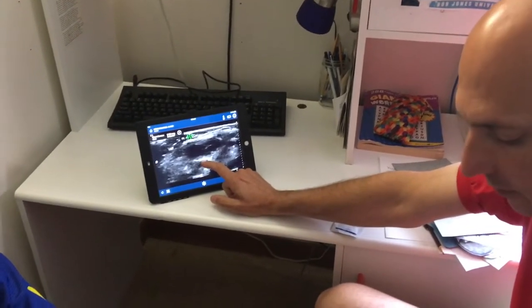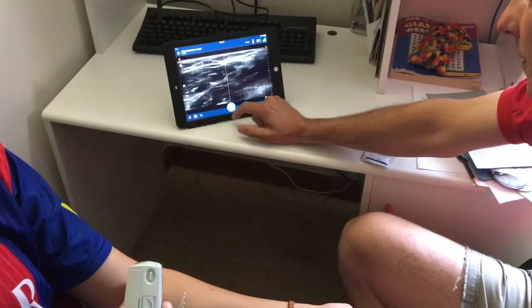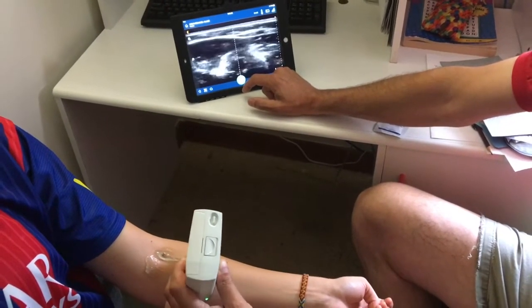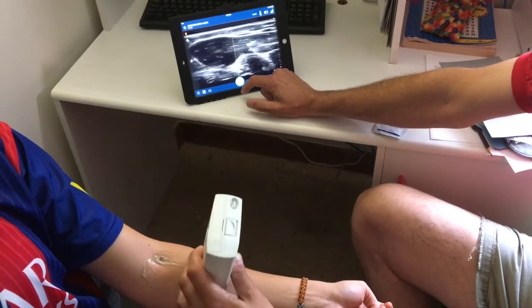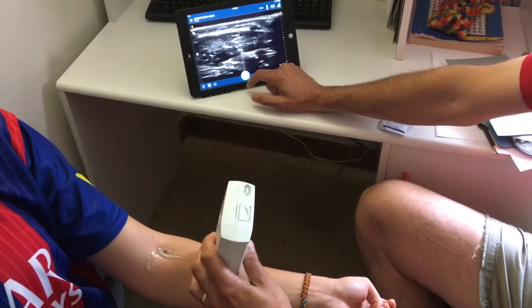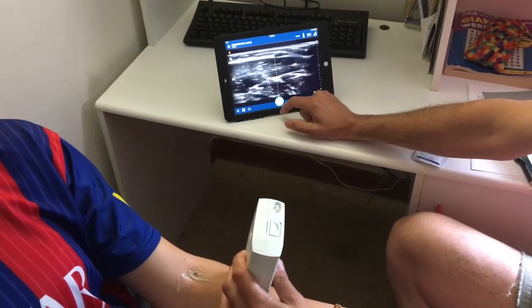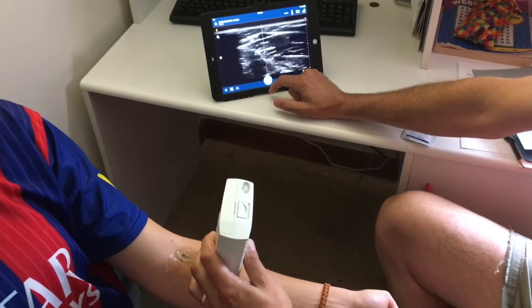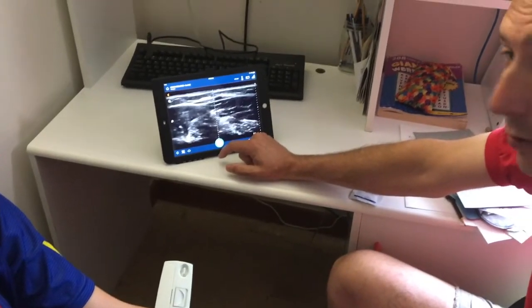The scanner is set to go to sleep in one minute if it's not being used, which saves the battery — we can just cancel that. With the weight of this device, you can see it very easily collapses the veins, but like anything, you just have to manage that with your hand and muscle memory. Very good picture on this device.